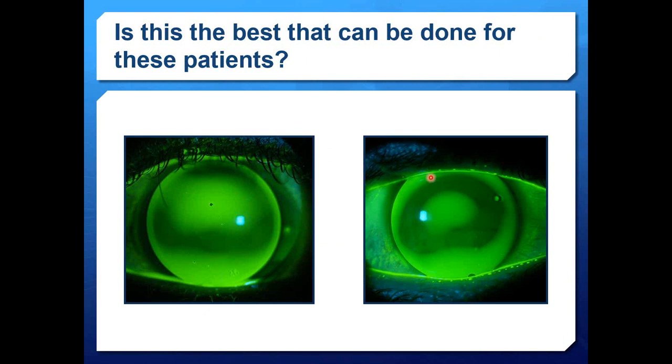And the same thing we see in this eye, where the cornea is very low in elevation, we get this vault. Then it's high in elevation, we get the bearing. Low, we get the vault. High, we get the bearing. Low, we get the vault. So what kind of contact lens will actually align to that kind of surface? And this is where scleral lenses are really beneficial, and where I should have been thinking more appropriately about the kind of asymmetry that we deal with in some of these keratoconic and post-surgical corneas.